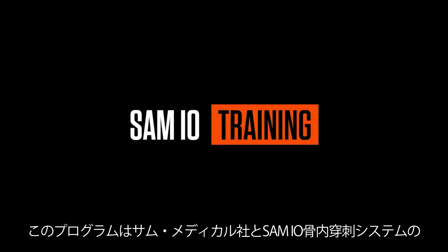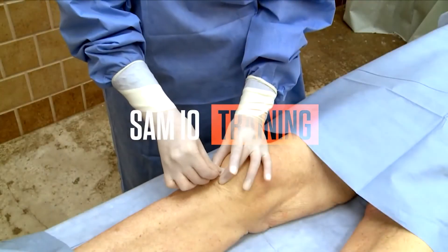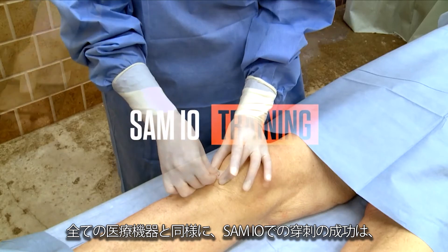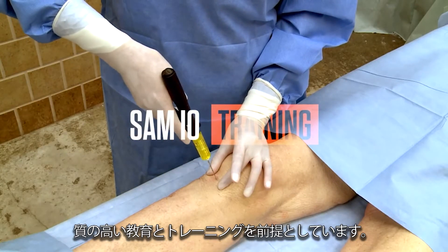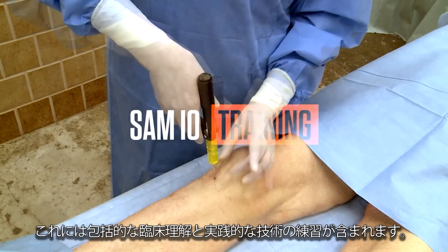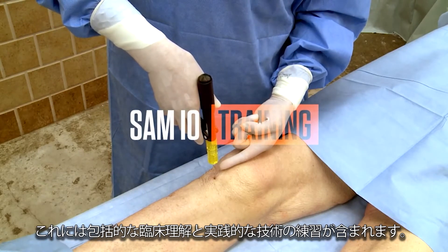The following program was created specifically for SAM Medical and the SAM-IO interosseous access system orientation and training. Successful SAM-IO access, as with all medical devices, is predicated on quality education and training. This includes a comprehensive clinical understanding, as well as hands-on skills practiced.